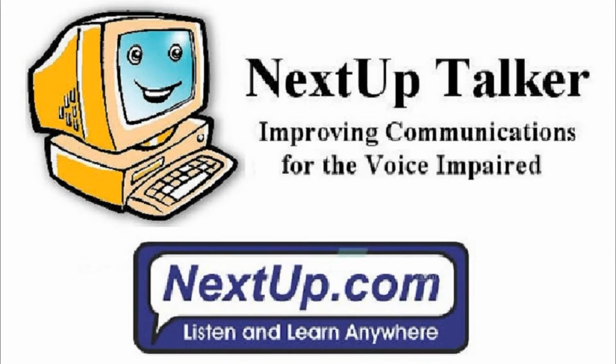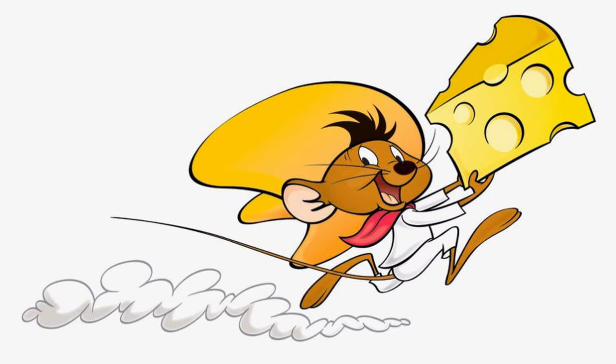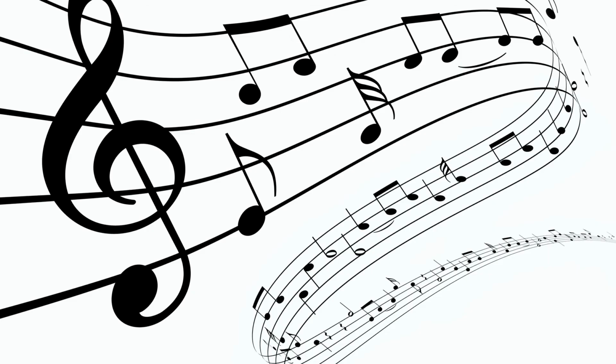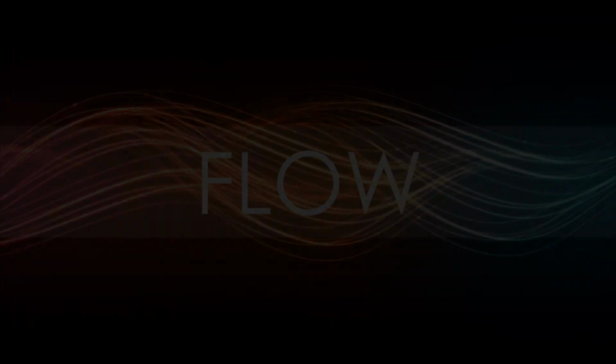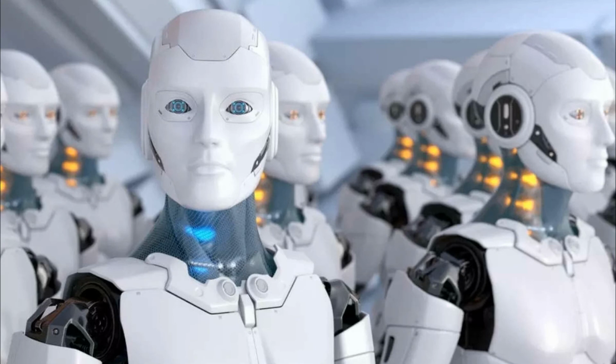Another advantage to Nextup Talker, you can not only change the speed of your voice, but the pitch of your voice as well. You can also change the flow of the phrasing, so you don't sound like a robot. I am a robot, you can't sound like me.